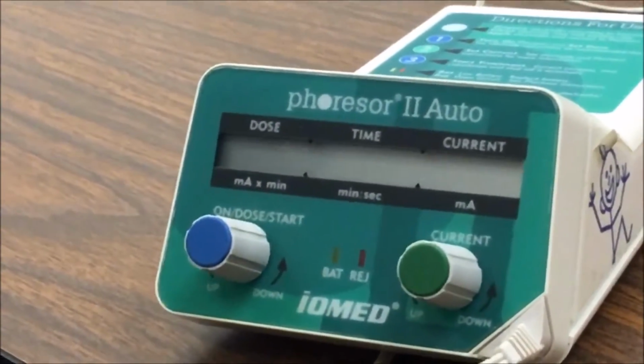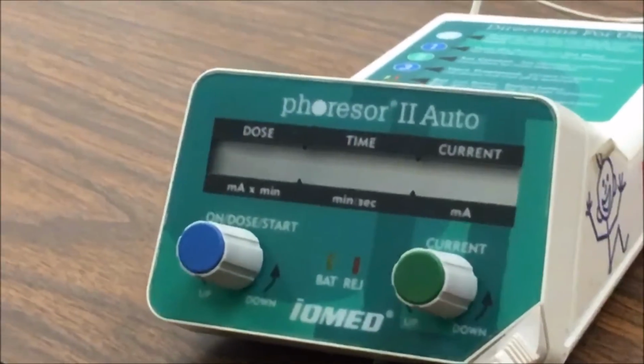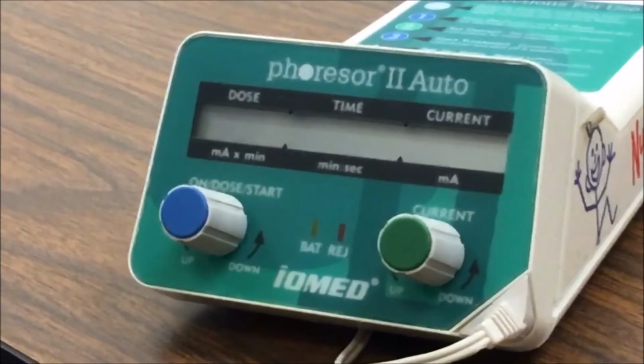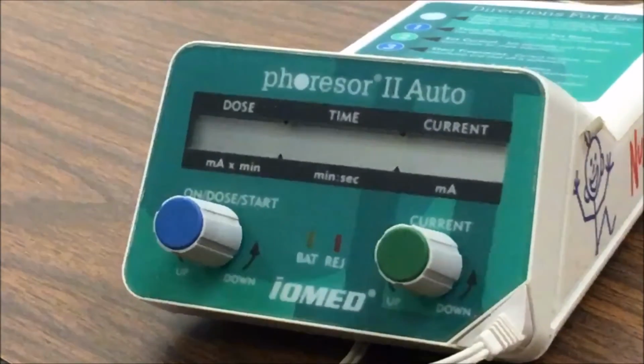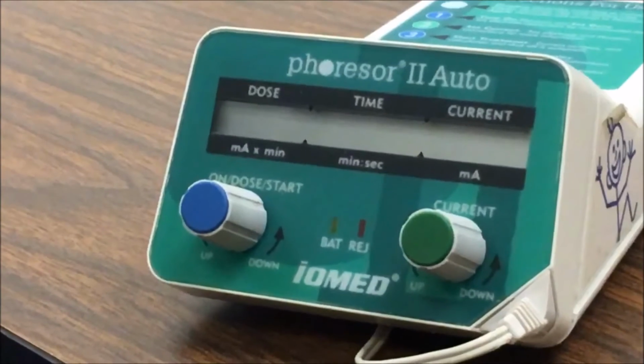However, we must keep in mind how much current the patient can tolerate, which might increase the treatment time. Therefore, it's recommended to start delivering the drug at the maximum 4 milliamps and lower the current during the treatment as we gauge the patient's comfort level.